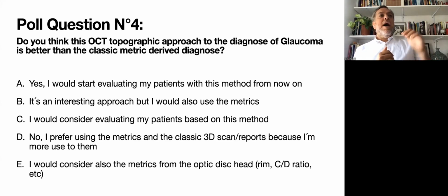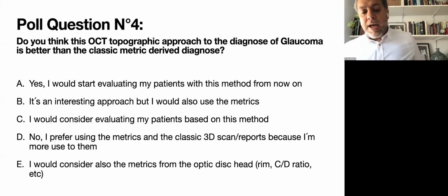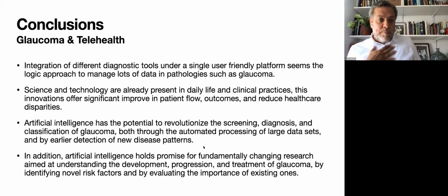I would like to have IOP testing. I would like to have topographic views. I would like to have corneal assessment to be sure that the thinning of the cornea or several other pathologies won't affect these measurements. The last thing that I will be looking through are the metrics, because it's proven that metrics will sometimes give us a wrong diagnosis. I do look at the metrics to get an agreement with everything that I have been looking through, but it's not my primary concern.